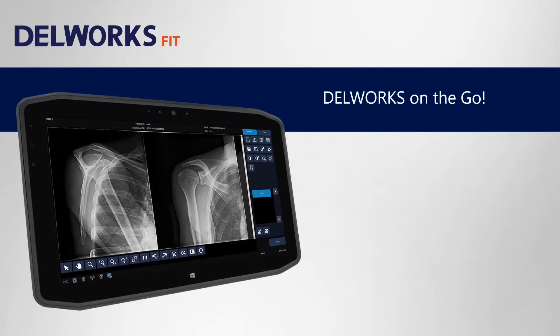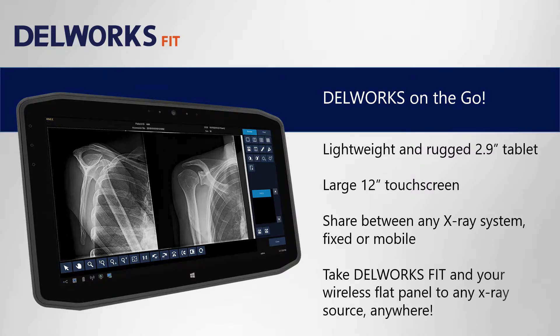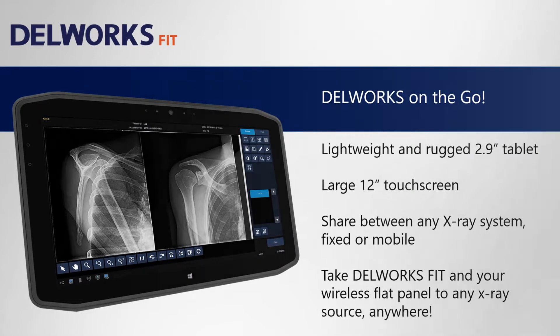The DellWorks Fit tablet-based workstation allows you to take DellWorks on the go. It's lightweight and rugged at just 2.9 pounds and has a 12 inch touch screen. You can share it between any x-ray system, fixed or mobile, and take DellWorks Fit and your wireless flat panel to any x-ray source anywhere.